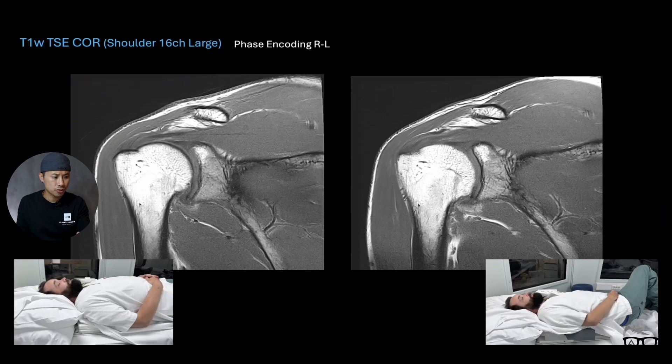We also did another test — I think this was my own shoulder. I just wanted to lie in and test out how the patient lies, how comfortable or uncomfortable it can be, and what we can do to adjust it. As you can see here without any window level enhancement, there are some motion artifacts, and these motions will carry through all the image slices. With the oblique positioning it's less — I couldn't eliminate it totally on myself, but we did minimize it, and it was more comfortable lying inside the scanner as well.